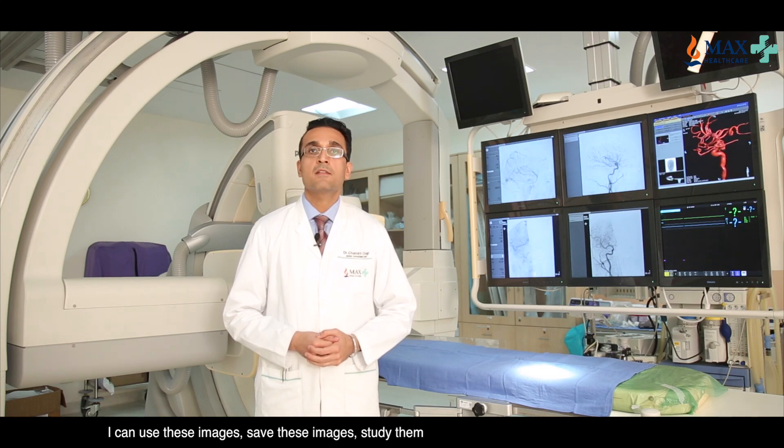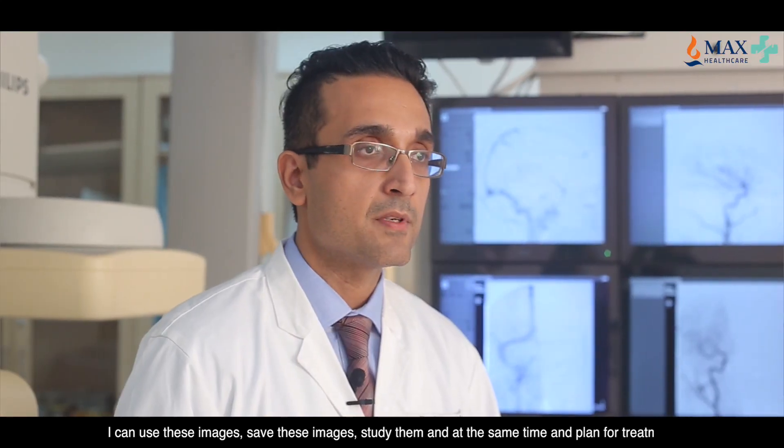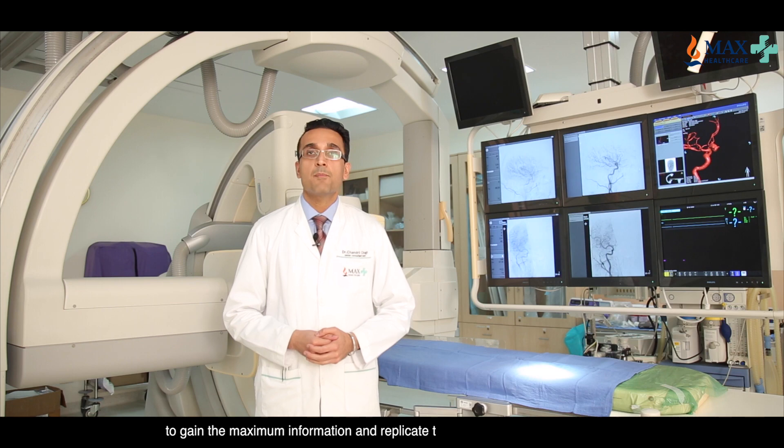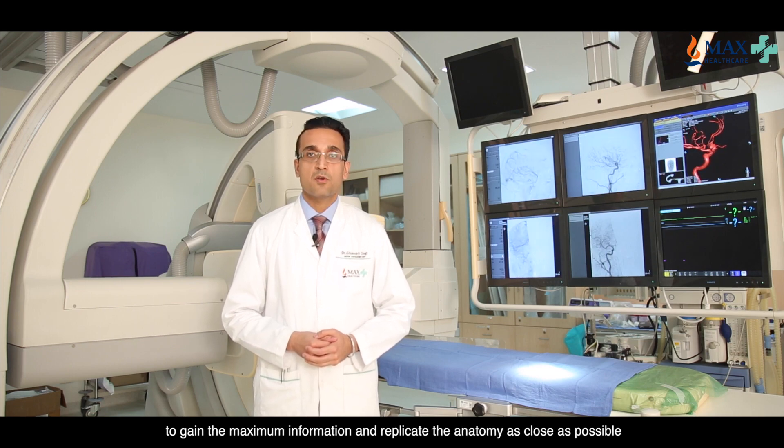I can save these images, study them at the same time, and plan for treatment. This machine also helps me to deconstruct the blood vessels in a 3D format to gain the maximum information and replicate the anatomy as close as possible.